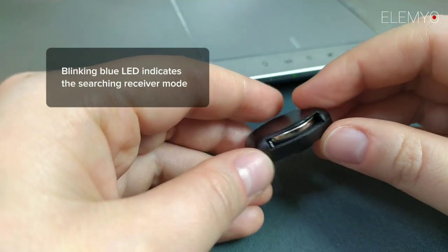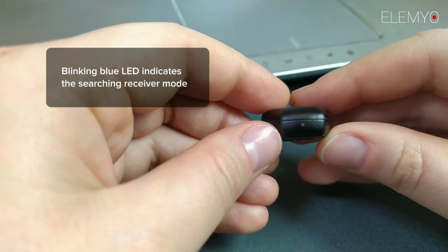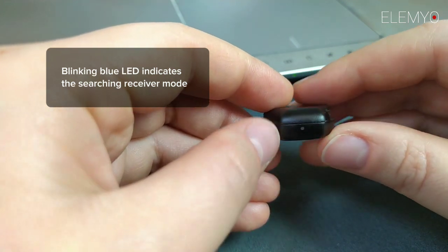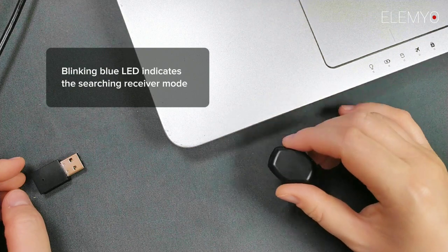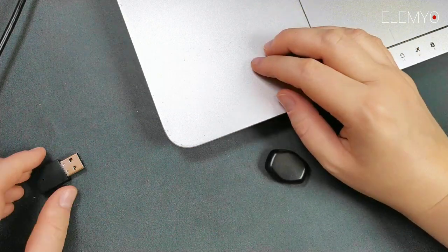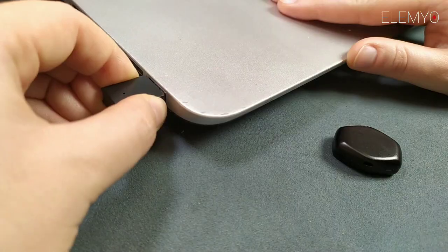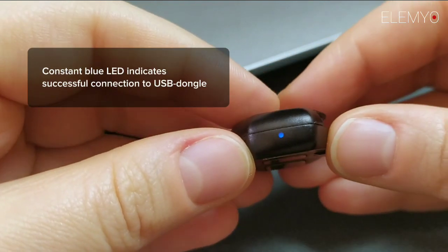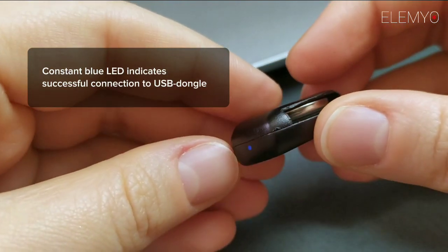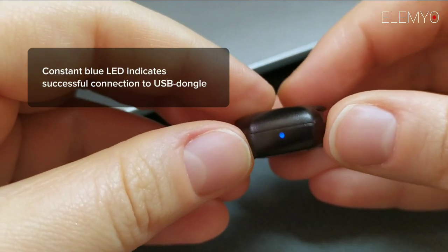Blinking blue LED indicates that the sensor is in searching receiver mode, because the USB dongle receiving signal is not connected to a computer. The USB dongle connected and the constant blue light indicates that the EMG sensor has successfully found the dongle.